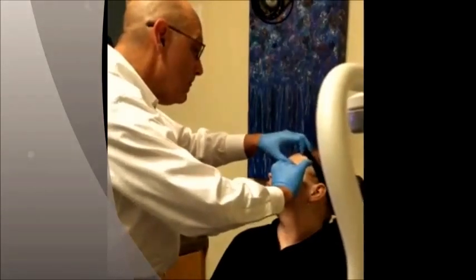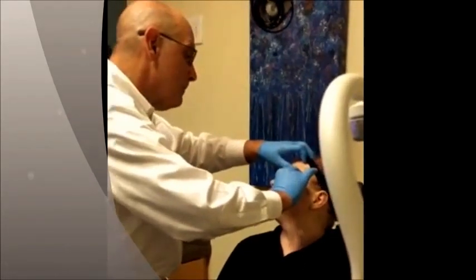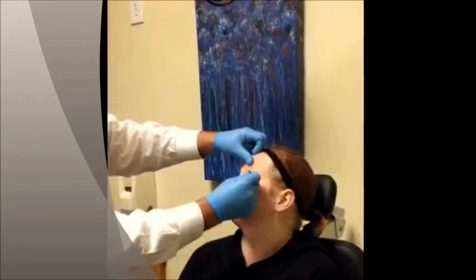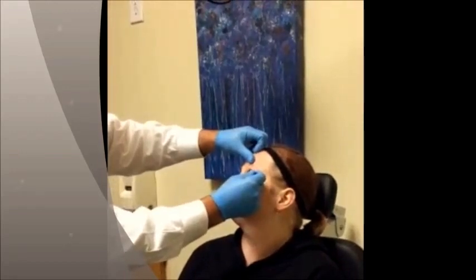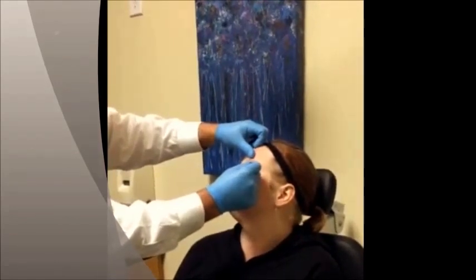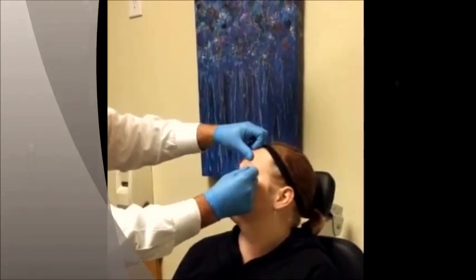What you see here is me putting in the lid retractors. I put anesthesia in the patient and typically explain to them exactly what I'm going to be doing. I take the surgical spear and dry the surface of the eye very well. I typically place about three drops of anesthesia before placing the lid retractors so the patient is more comfortable and the anesthesia is a little deeper. I avoid the Tetravisc type of anesthesia as it tends to be very thick.